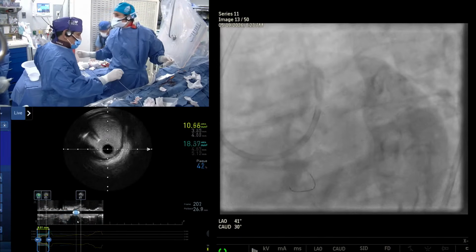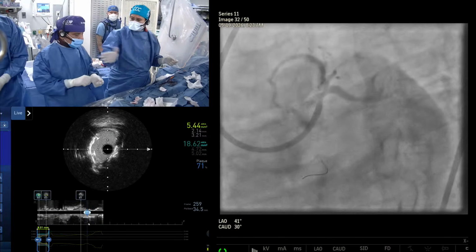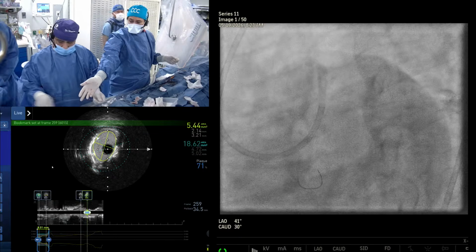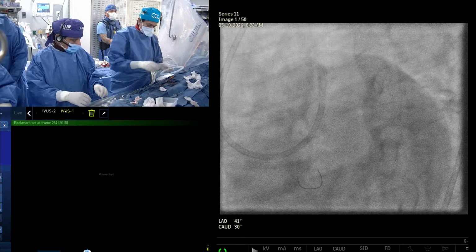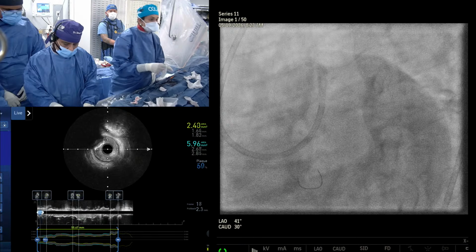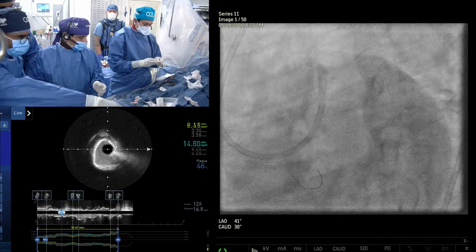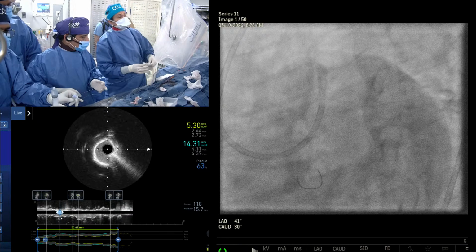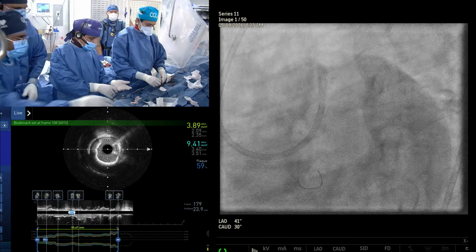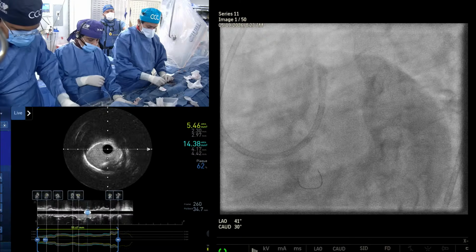What is it? No, that's 20. Yeah, good. 3.0. No, hold on. Let me finish the circ. You're going to address the distal lesion first, no? Yeah, circ, yes. What stent are we doing? This was the Synergy case, right? Synergy on the right side? That's okay, we can do anything, whatever you want. 3.0, 3.5. Circ looks 3.5. Yeah, 3.5, 16.